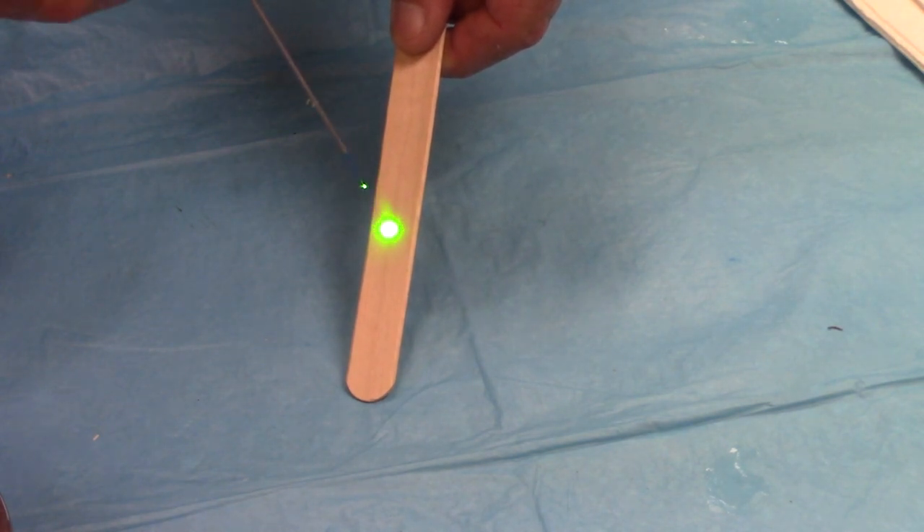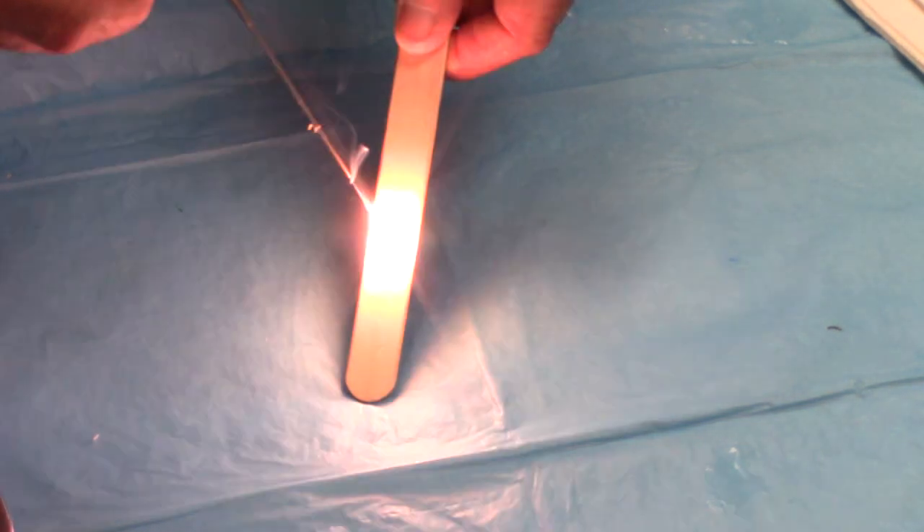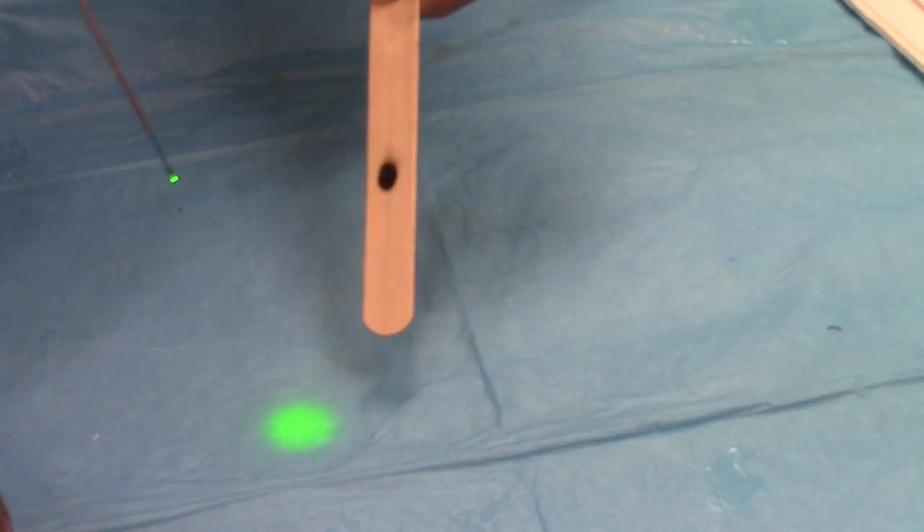It's firing. We're going closer, closer — there we go. Yep, that's real. That works.